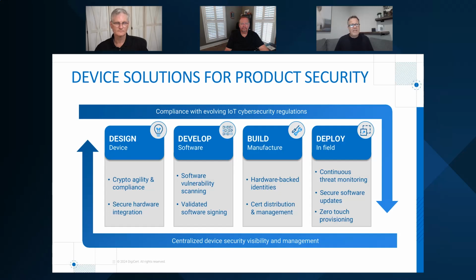And is that device now using those hardware backed identities, those keys and certs that are baked into hardware? And if we have to send keys and certs and other secrets to our third parties, are we doing that in a highly secure, auditable fashion? And then when the device leaves the factory, are we able to provision that device in a zero touch manner?